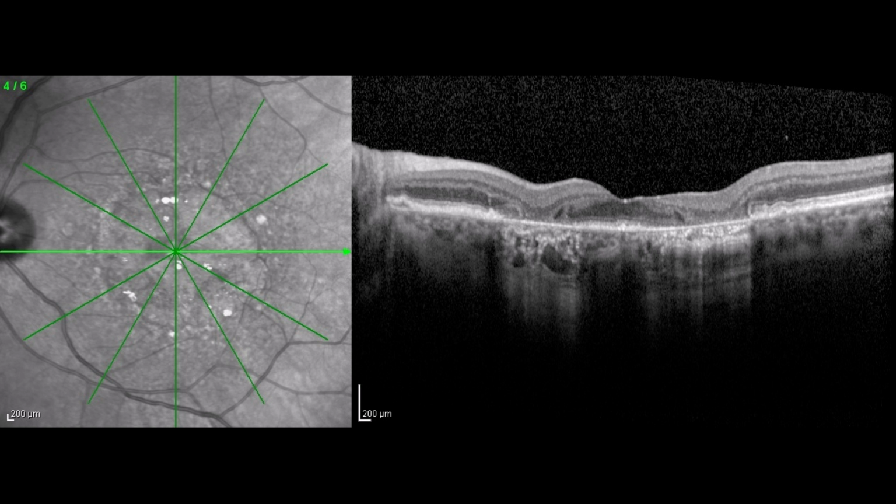And this is something missing in the outer retina, and we'll be winding things up. So when you see a patient like this, you don't just see a patient with an OCT as much as I would like to, but you see what looks like a bullseye maculopathy. You see this lossy ellipsoid zone, ELM, just in the parafoveal region. If you look at the radius all the way around, they all look like that. So then you have to ask yourself why.